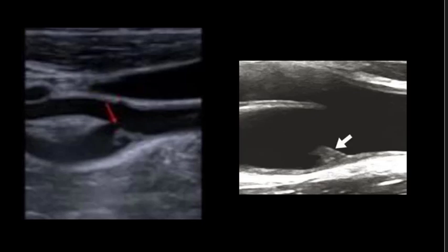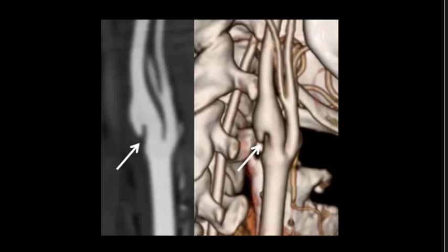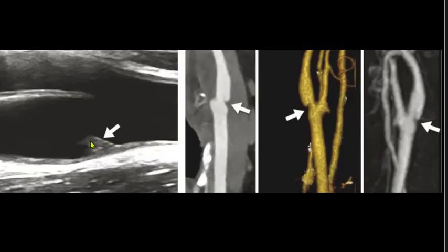Its differential diagnosis and treatment. Here we can see a CT angiogram with 3D images. We can see a shelf-like projection because of a web in the proximal internal carotid artery on both images. Here we can see on ultrasound of the carotid there is a shelf-like projection in the proximal portion of the internal carotid artery. Similarly, we can confirm this on CT scan both on coronal formatting and on the 3D image.